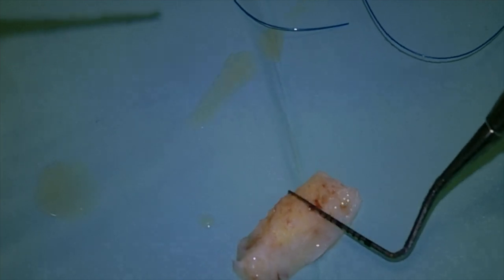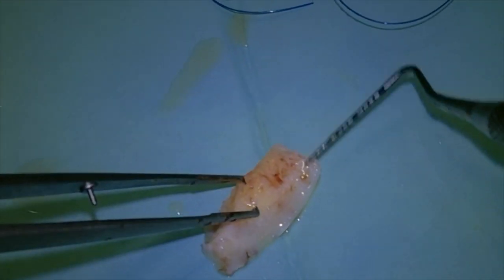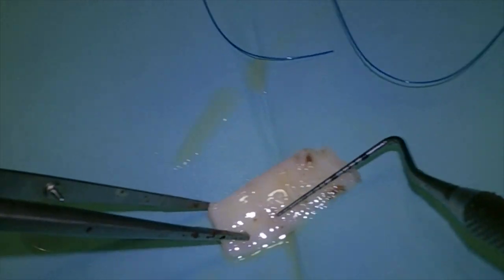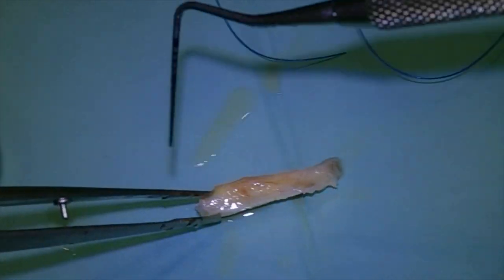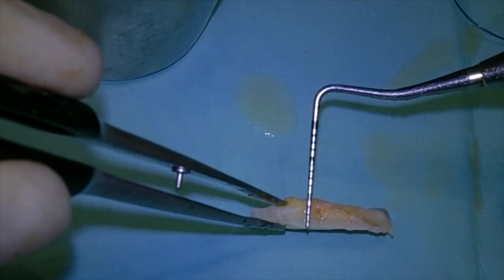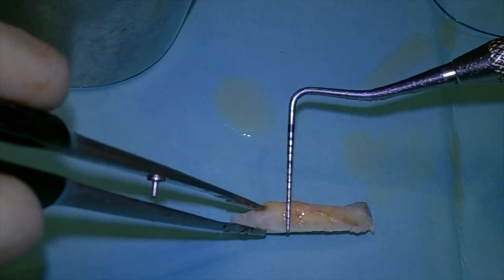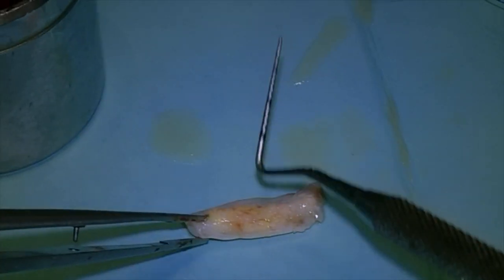That fatty tissue is going to interfere with the attachment of the graft. So in this case, if you want to turn this free gingival graft, and have in mind that the free gingival graft is the one where you leave the epithelium, which is going to be exposed, okay? And you're going to face that connective tissue, which right now is almost partially covered by fatty tissue that you're going to remove. You're going to expose it to the recipient side.